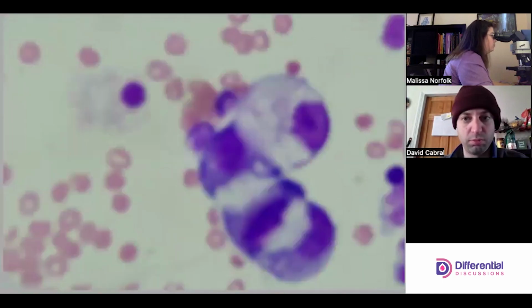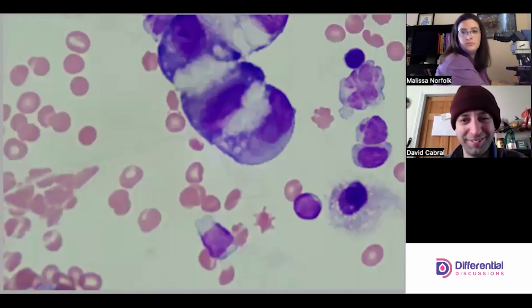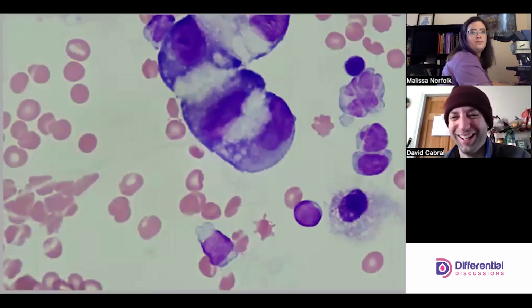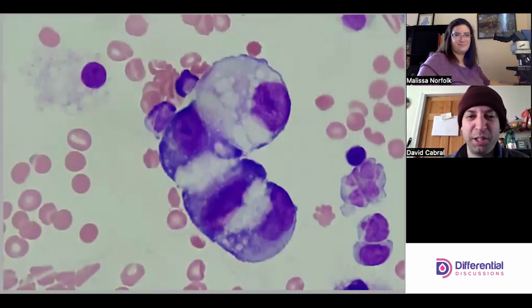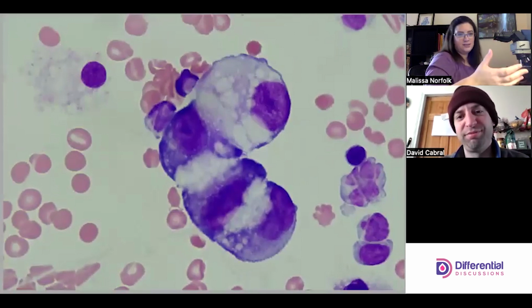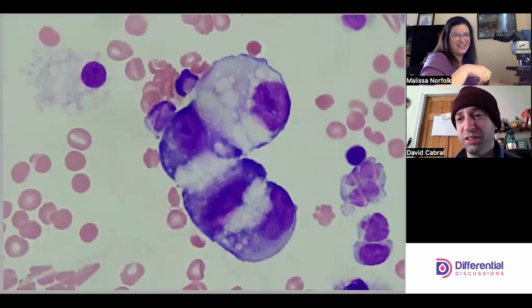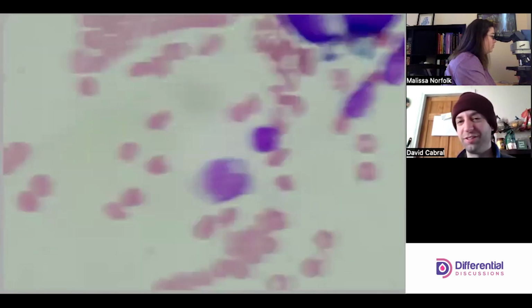Oh, I can't even begin to describe how terrible those are. Lum, yeah, these are ugly for all of the reasons. It's like if you asked a cell to just do everything wrong. Oh, and some more.